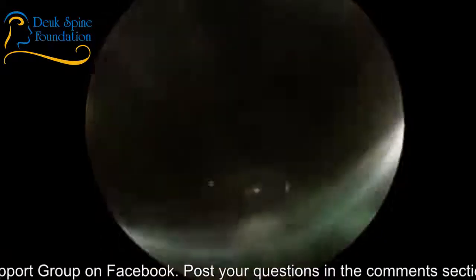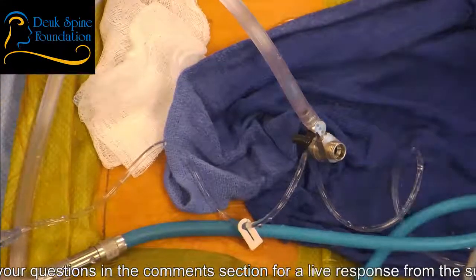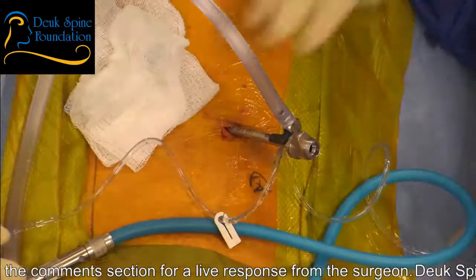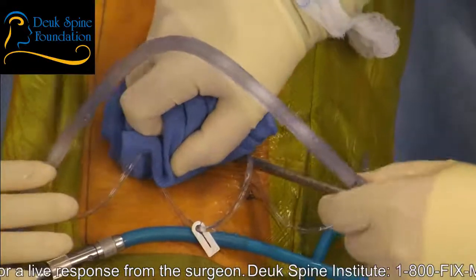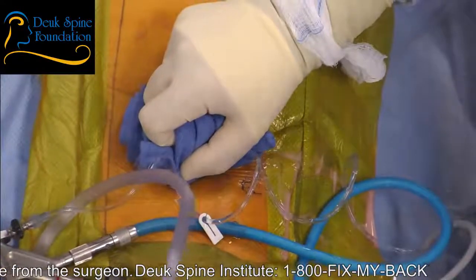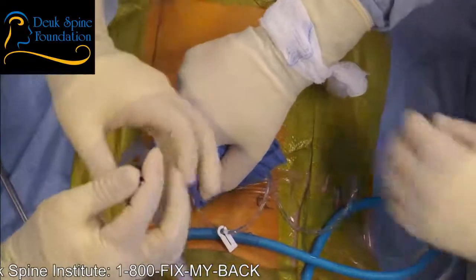That was the ligamentum flavum that I was zapping away at 12 o'clock. And that was the foraminal component. You understand? The part that goes into the foramen. Most ligamentum flavum is in the central canal, but a lot of people don't know it actually goes out lateral into the neural foramen, posterior to the nerve root. And then it buckles and it hits the nerve root in the back. So we were just zapping away the ligament to keep it from pressing on the nerve root from the back and pushing it against the disc herniation in the front, which we got rid of as well.